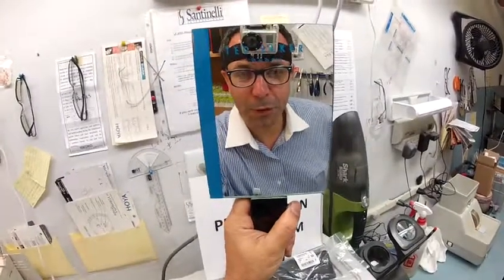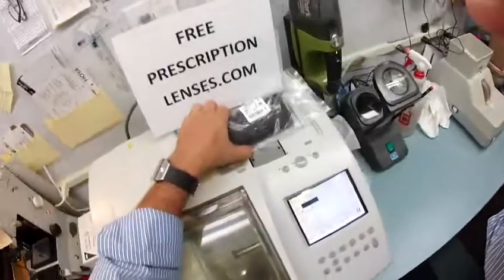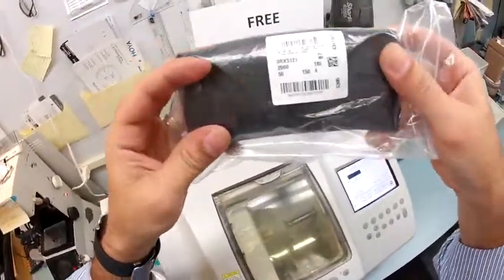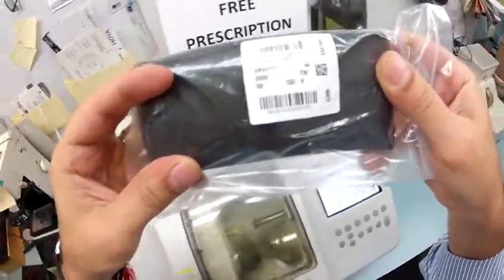Yo, Sergio in Boundbrook, New Jersey. Matthew here with FreePrescriptionLenses.com and I'm going to show you how I cut photochromic transitional lenses for your new Ray-Ban 5121, the Wayfarer color 2000, which is the classic shiny black and the 50 millimeter size.